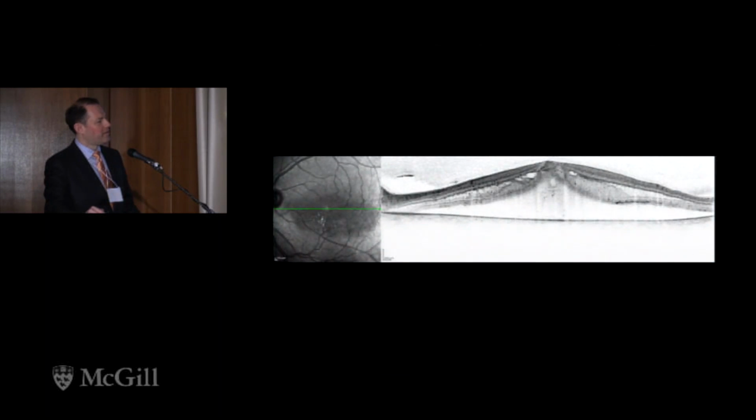And 1 day later, this is his OCT in the fovea. So in addition to having CME, there's a lot of subretinal fluid as well that's migrated centrally. The vision is down. Patient's not happy naturally. And you can see here on this IR picture pretty much the extent of subretinal fluid that's there.